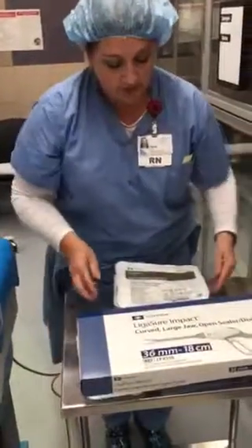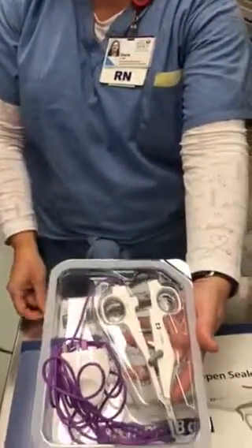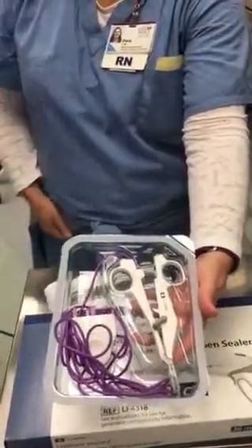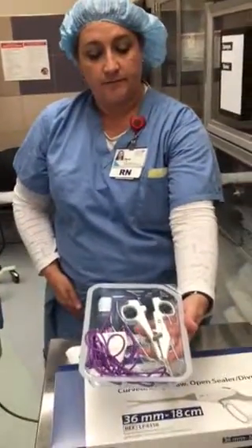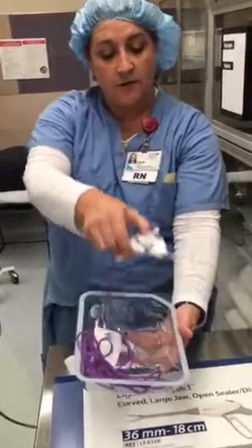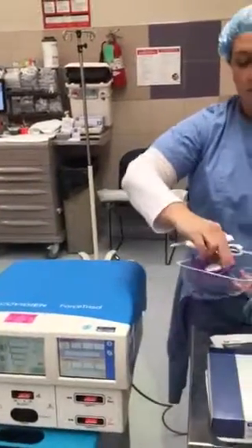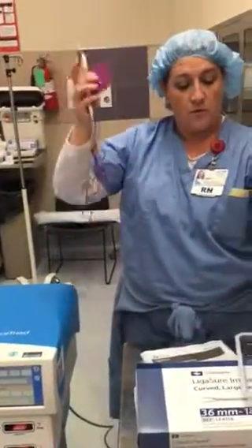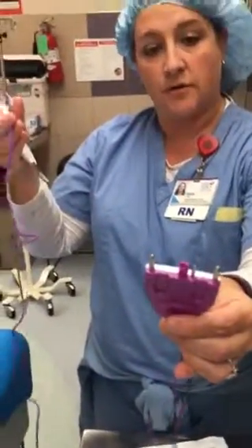So once we know which device our physician would use, we would open the package sterilely. There's always a little loose tab here. I would pull the tab towards me, leaving this package open for the tech to grab this instrument sterilely and place it onto her field. Once she has done that, this is the part she will have kept sterile. You will then need to come in with this piece. Notice the cord is purple.